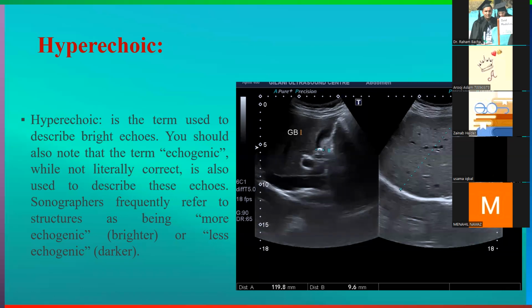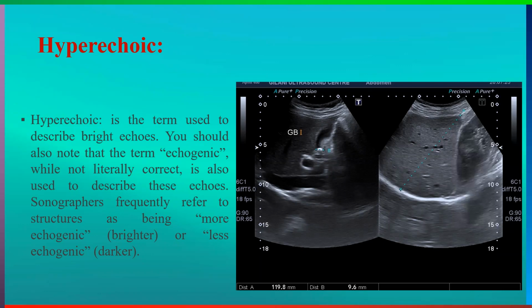But again, I will tell you that some structure will appear to you as more echogenic, but it will appear to someone else as less echogenic. So that's why this is subjective.